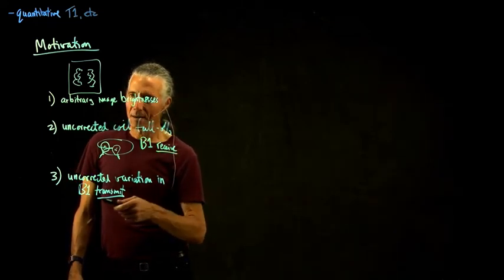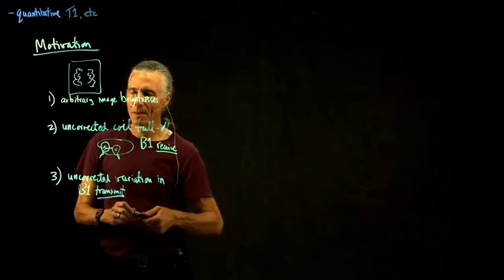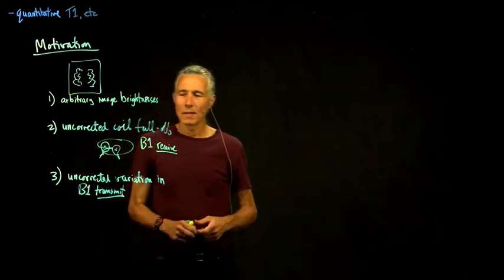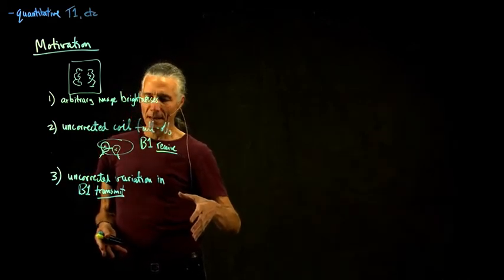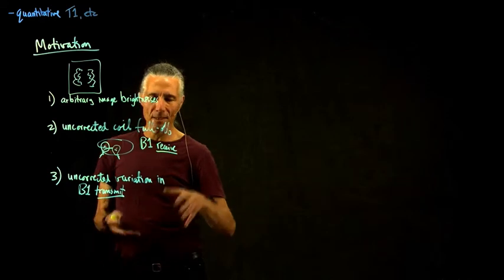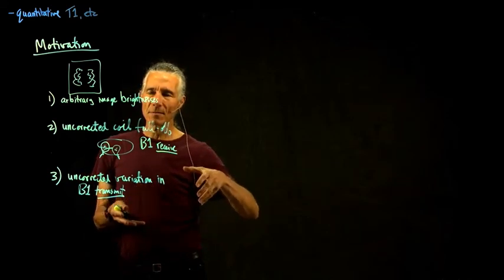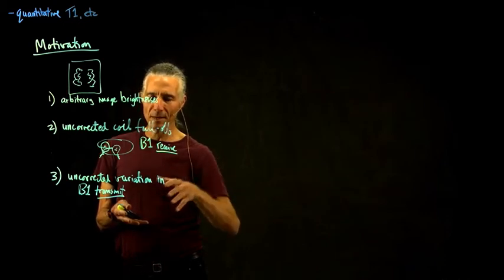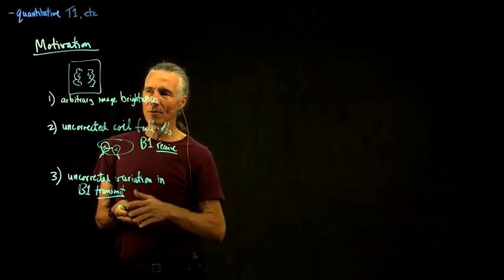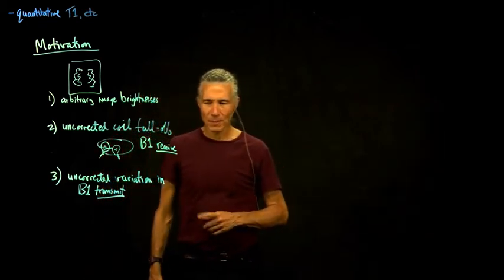And in most cases nowadays, we're transmitting with the body coil. So that coil is relatively big. And that's a good thing, because it's big and relatively far away from the body, so it's going to be able to transmit a nice uniform signal throughout the bore. But that's not the problem. The problem is you put something in there.